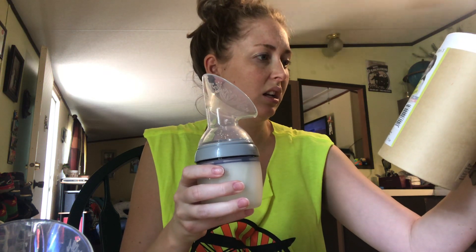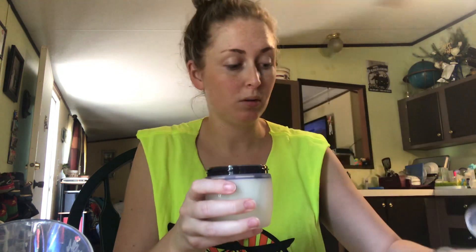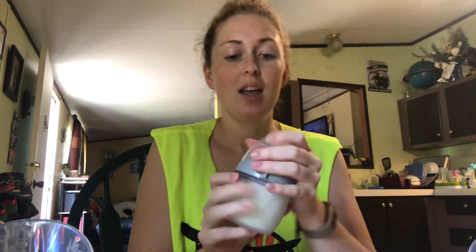It comes with a removable — I don't know what this is called — but it is removable and you can put a nipple directly on the bottle that you just pumped into. And these nipples have fake Montgomery glands on them, which is supposed to help a breastfeeding baby think that this is a boob.